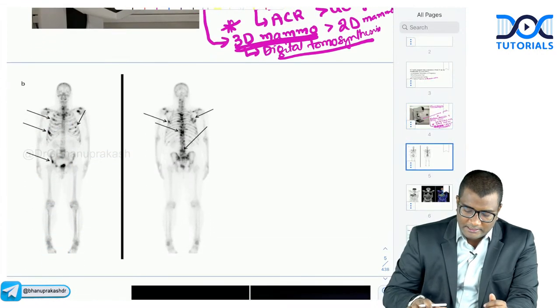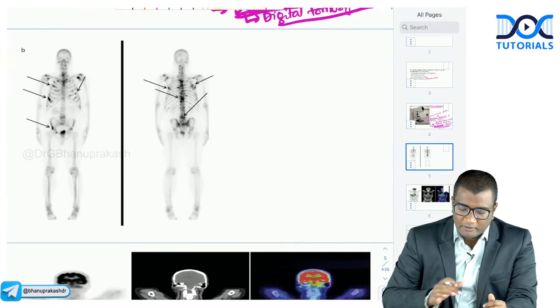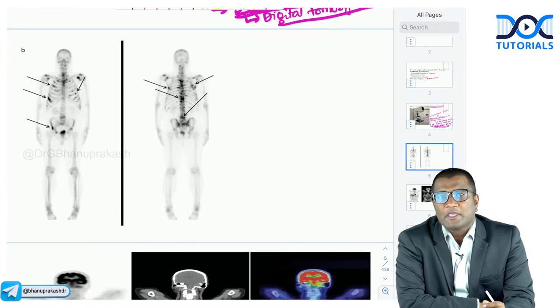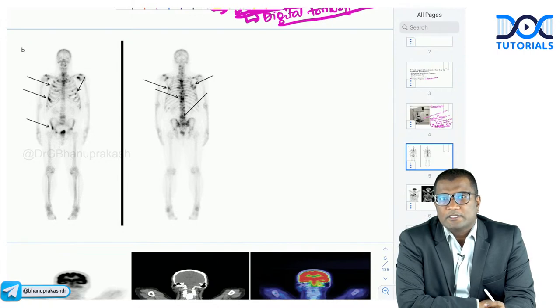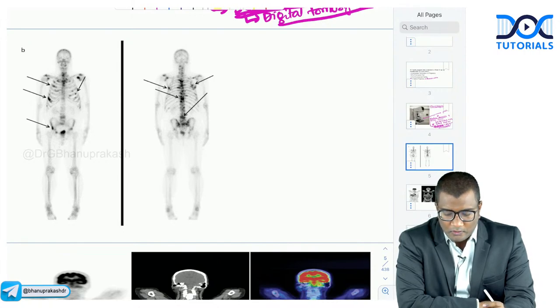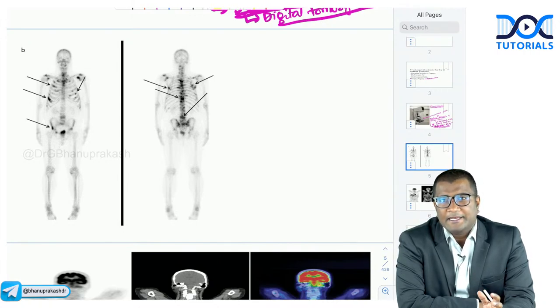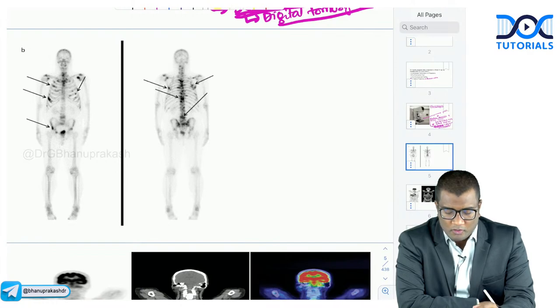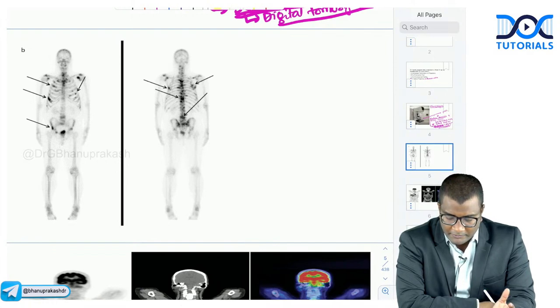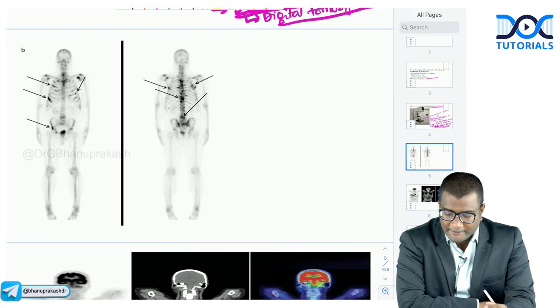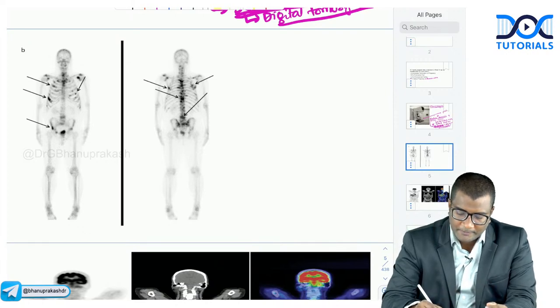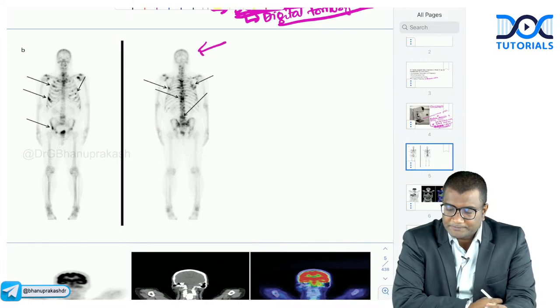Moving to the next image — what investigation is shown here? Is it a CT scan, MRI, PET scan, or another investigation? What do you think this image represents?